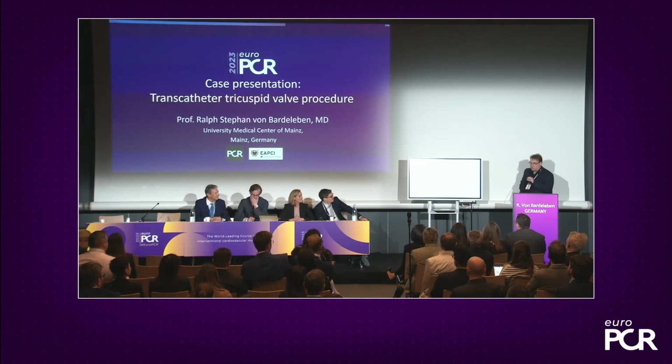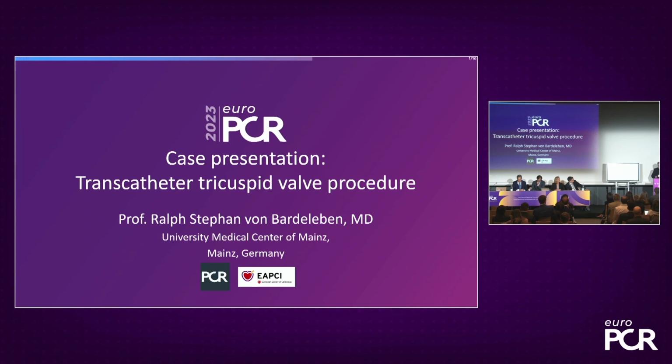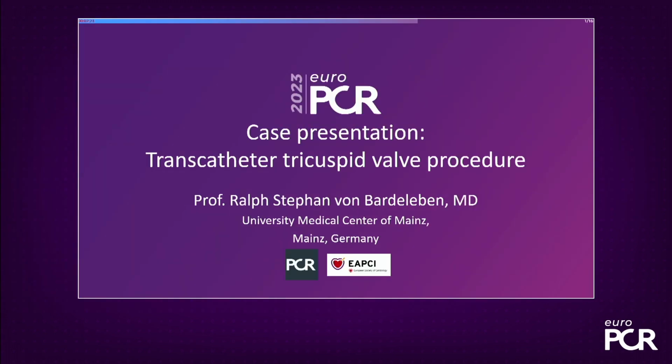There's a company in Berlin that remodels, but the quality deteriorates over time. So we have done second use and third use cases. There's a professional company, and it's allowed, but it's not recommended if you do a very important case. The crystal or the device will deteriorate over time, so we usually use it only one time.